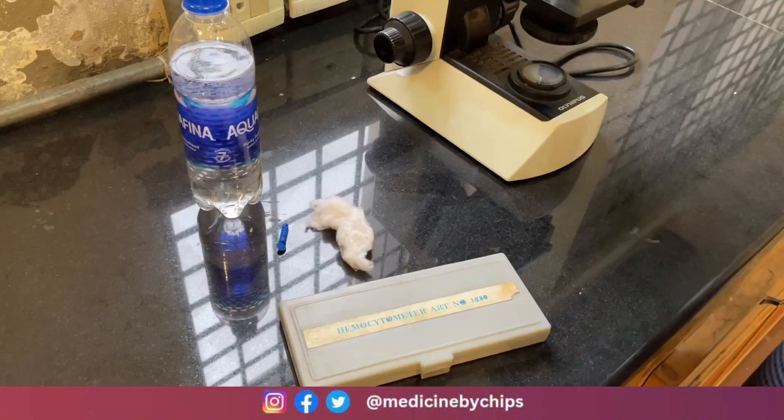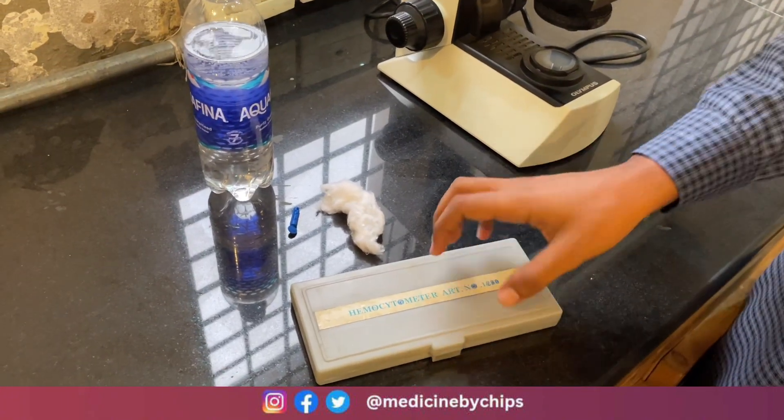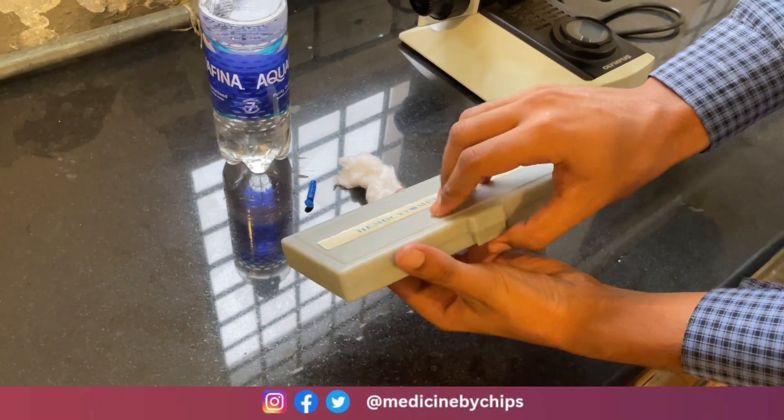Assalamu Alaikum, welcome to Medicine by Chips. Today our topic is RBC count. First of all, we will discuss about its apparatus. We have the hemocytometer, which is used in RBC count.